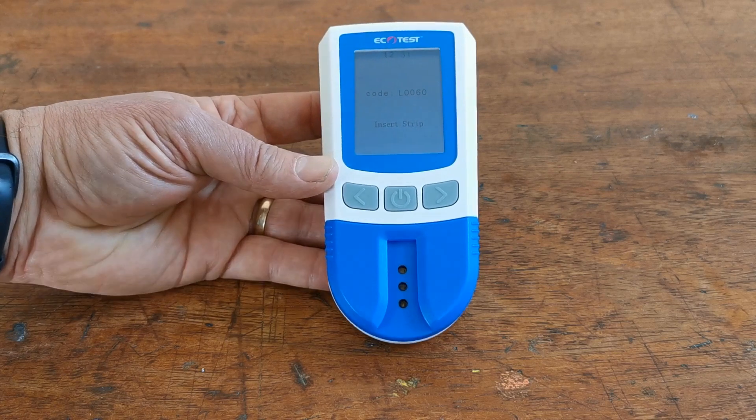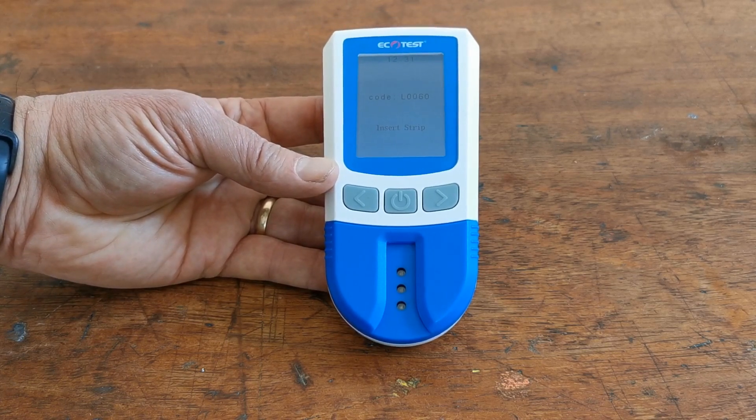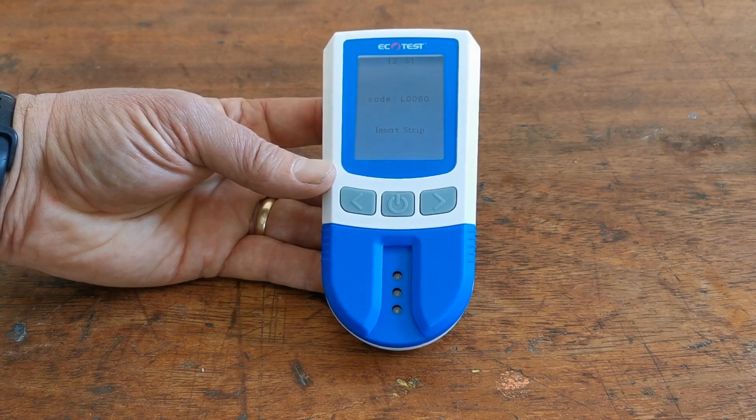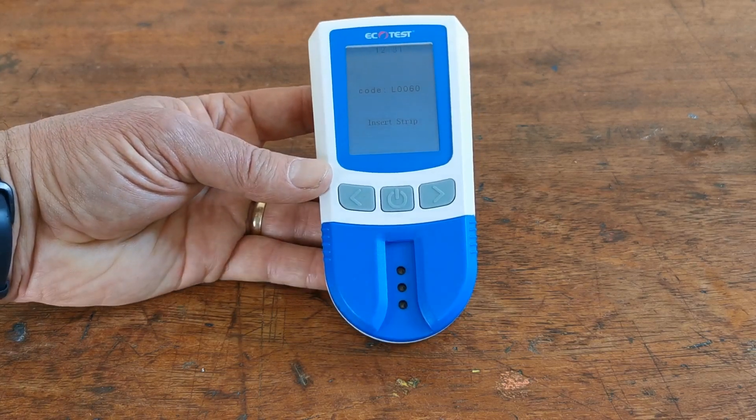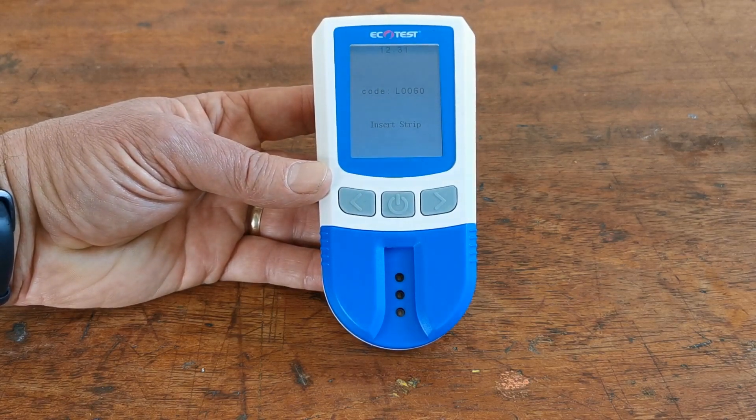What I'm going to show you now is how to set the time and date, which is important if you want to use the memory function. This meter holds 500 memories, and if you've set the time and date it will also tell you when each reading was taken.